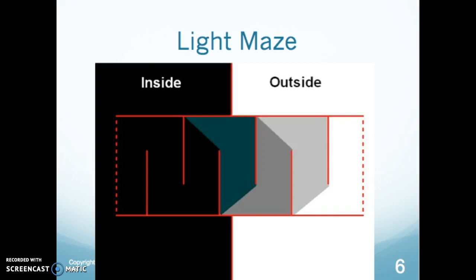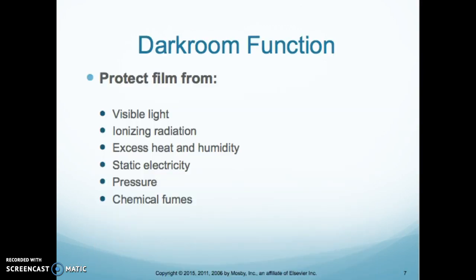The light maze, it's not very common, but I wanted to show you how it worked. You just come in, you can see the light getting darker and darker and darker till there's no more light, and then you come out. But as you can see, it takes up a lot of room, and per square foot, we don't have that kind of room in radiology.